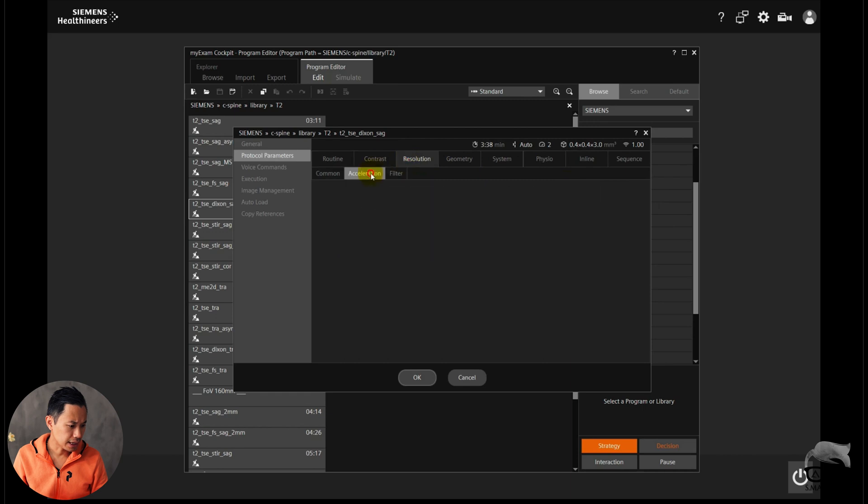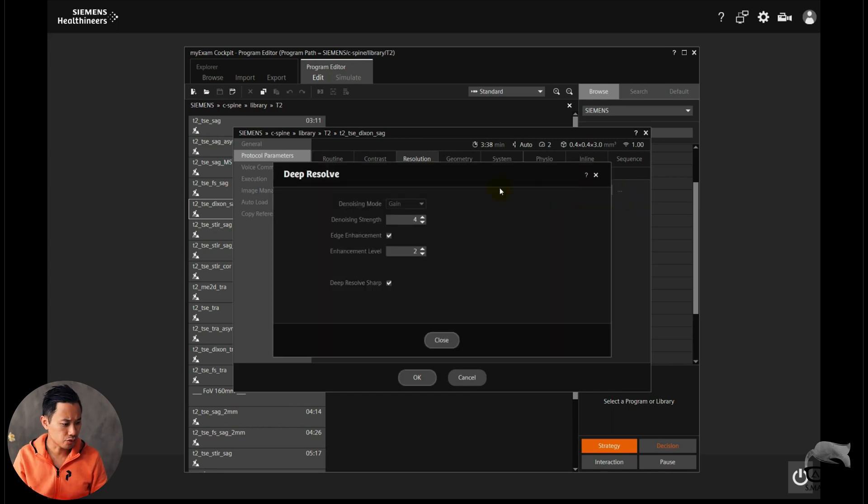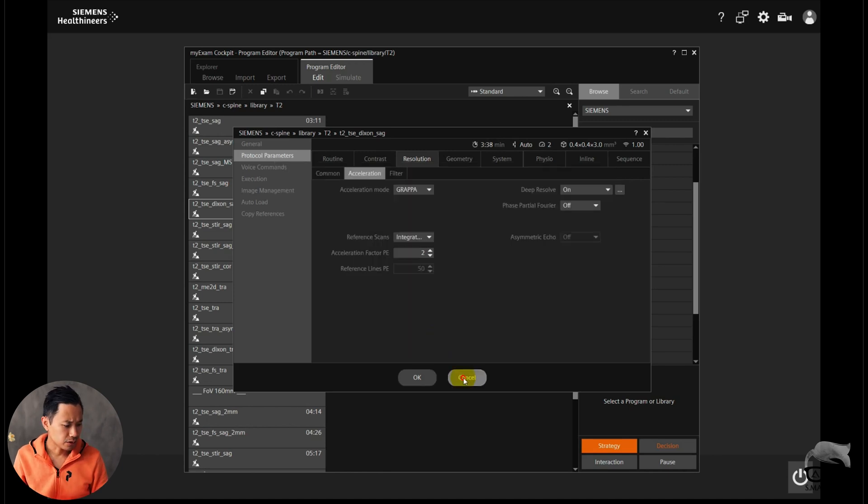Let's go to Contrast — you can see the thickness right there. The next thing you can see is the acceleration mode. You have what is called Deep Resolve — either turn it on or off. Whenever you turn it on, you only have the possibilities to choose DR Gain and DR Sharp. The latest one, Boost, is not available yet on 2D Turbo Spin Echo Dixon — hopefully in the future.